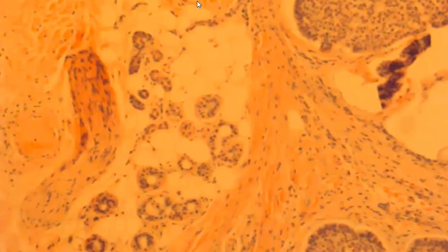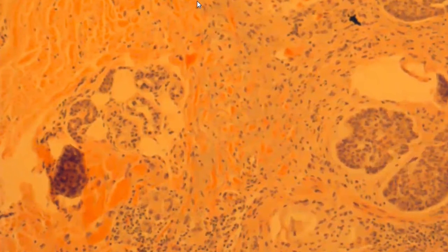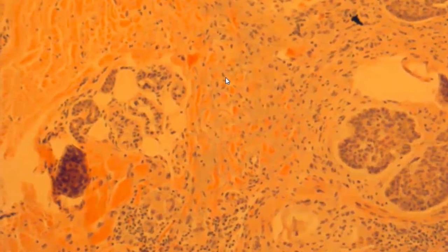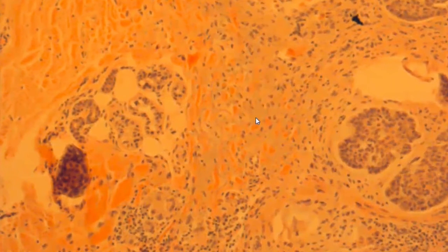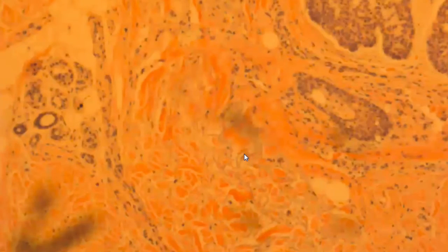This is some skin appendages. This is the dermis, some adipose tissue. I just want to show you another feature. This is what we call the solar damage. You will find here a difference in color between this red reticular fibers and this grayish one. This is what we call the solar damage, and this is a sign that this patient was exposed to chronic sun exposure.